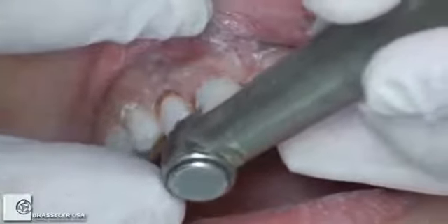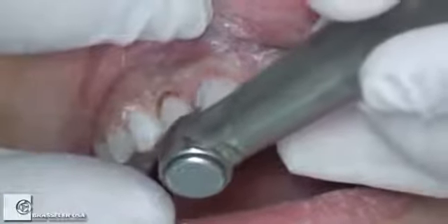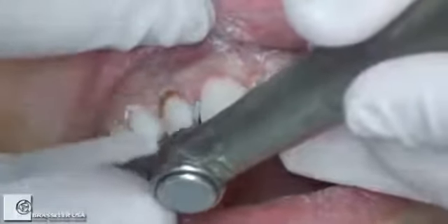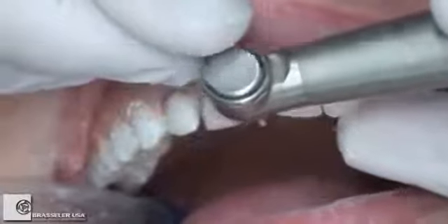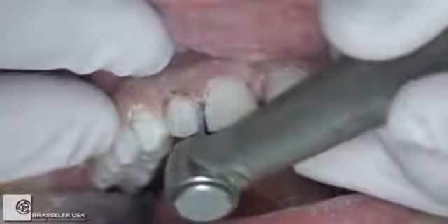Again, since we're preparing, I'm taking that burr you just saw a second ago at the distal incisal line angle so that I could round that over a little bit, or distal incisal edge, excuse me. And we're coming along and doing really the same thing we did on tooth number 8, on number 9, now on number 8, putting a light finish line. Now I'm going to round into various regions here. I'm taking on the incisal edge here, and I'm just smoothing the incisal edge.